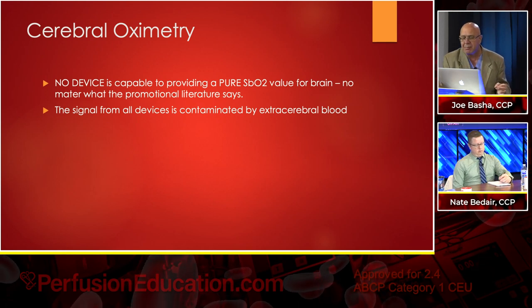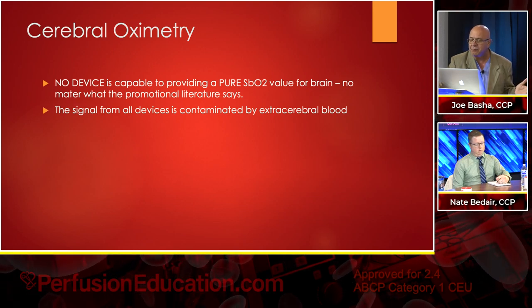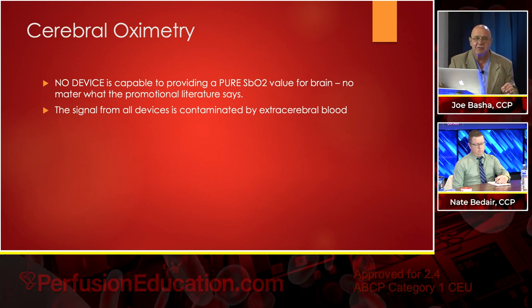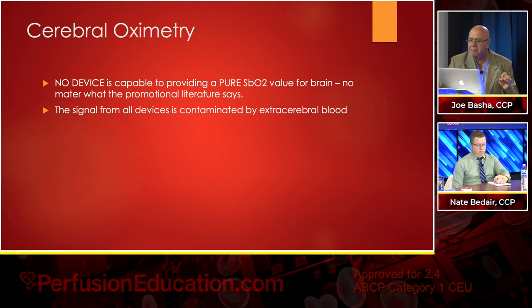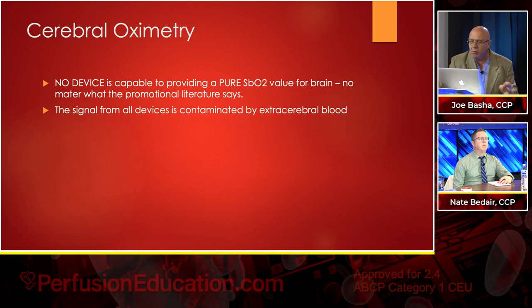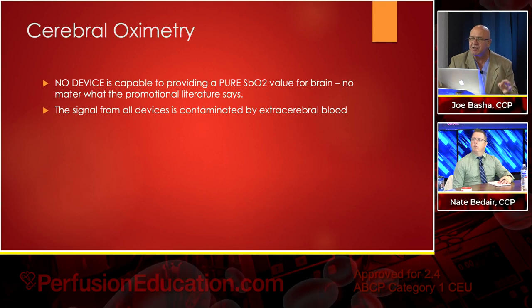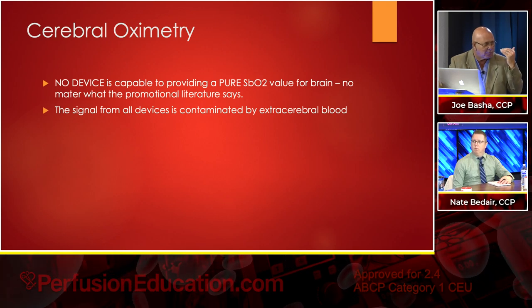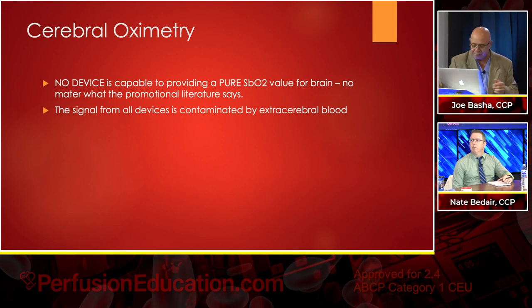No device is capable of providing a pure saturation brain O2, or SbO2, value for the brain, no matter what the promotional literature says. I'm going to say that one more time. No device is capable of providing a pure SbO2, that's the oxygen saturation of the brain, no matter what the promotional literature says. The signal from all devices is contaminated by extracerebral blood. Again, skin, bone, getting through the fluid layer, the cerebrospinal fluid, you have a lot to go through. The dura.